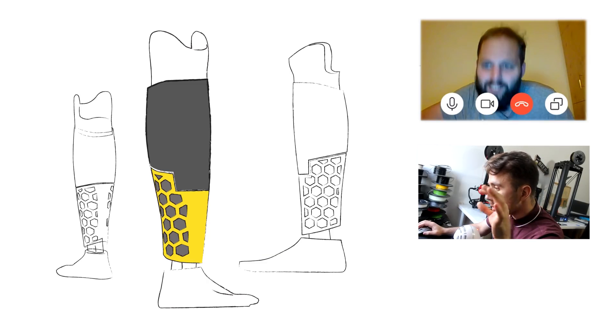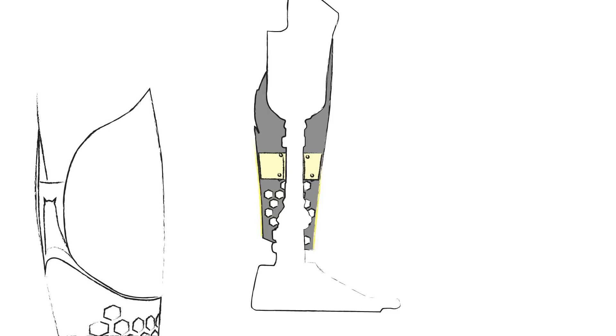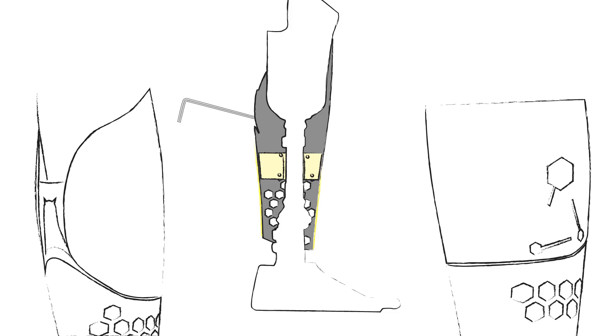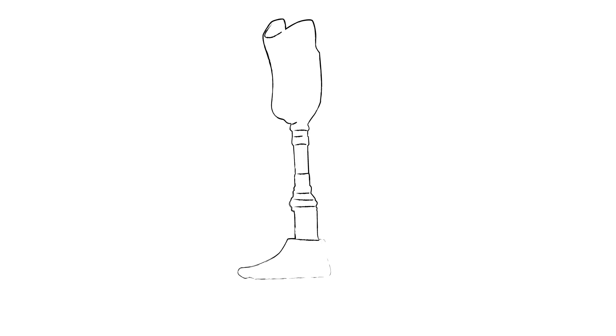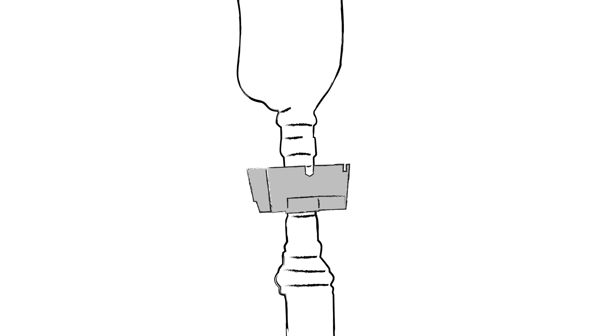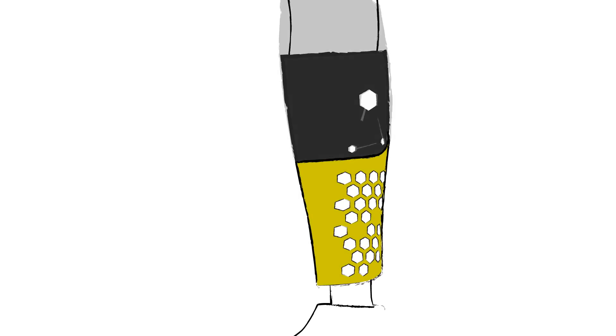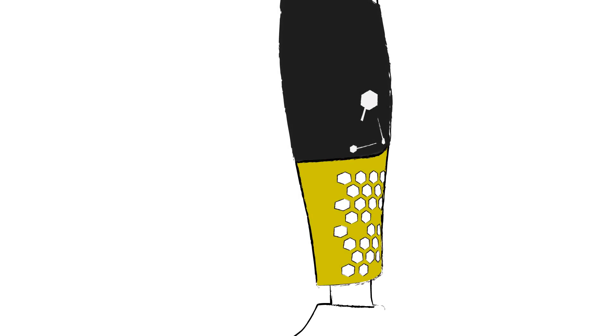I showed the sketch to Dominic and he liked it, but he asked me to raise the cut on the ankle, create a curved cut on the middle instead of a straight one, and make the hexagons smaller and more random. I also added cuts that function as access points to reach the inner screws of the prosthesis. The final design was made of four parts: the inner adapter that functions as a clamp to fix the cover on the prosthesis, the inner black part that gives a dark background look and holds everything together, and the yellow bottom part and top black part that are there to look cool.